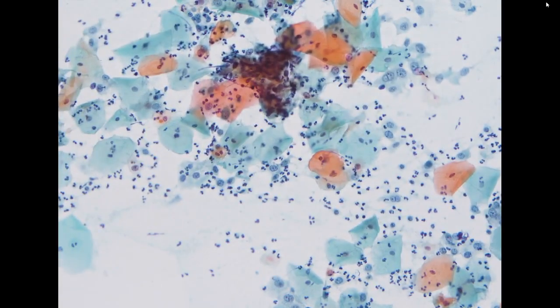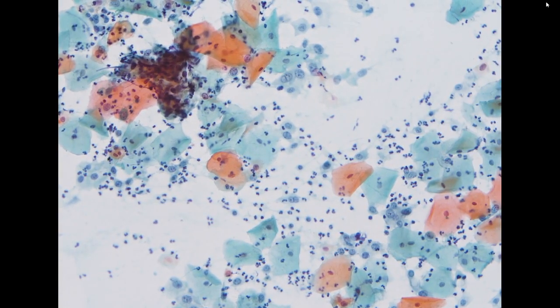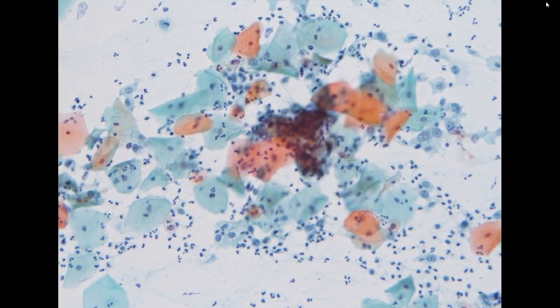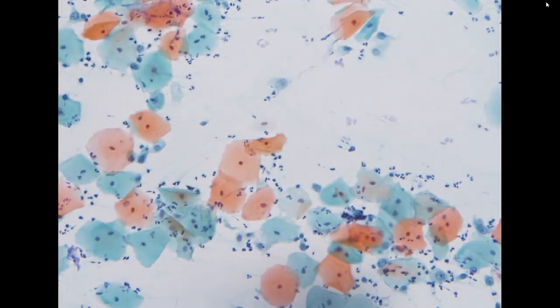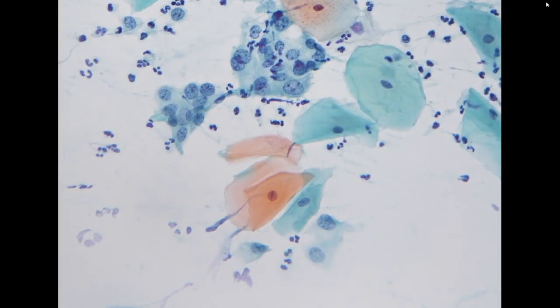But in this specimen, it's very difficult. There are some degenerative cells in the background, but no definite, unequivocal tumor diathesis. So I think it is okay that we call the specimen HSIL.